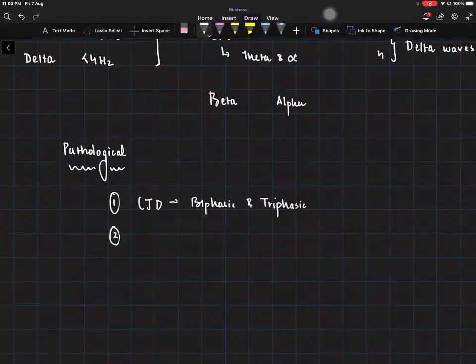Okay. In Huntington's, you will find low voltage, specifically no alpha.